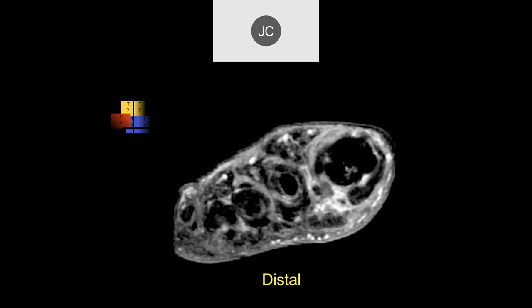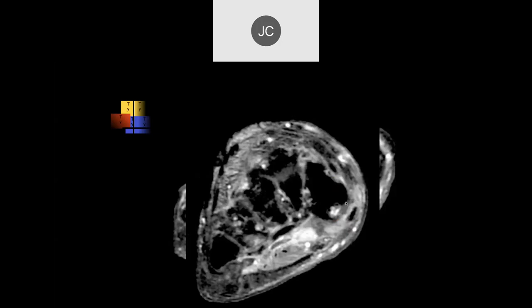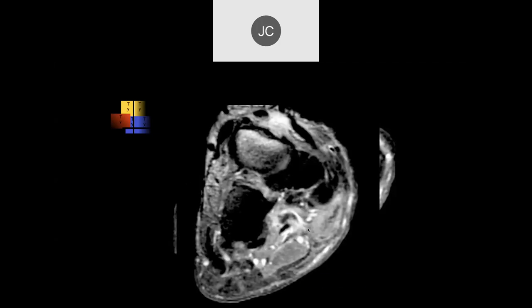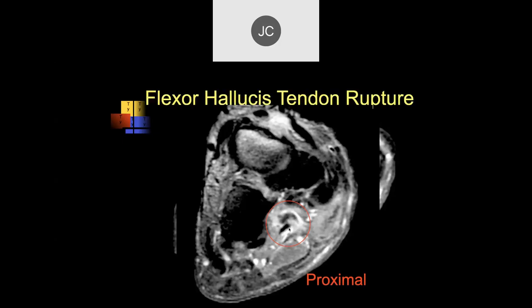There is high signal on the plantar flexor tendons — flexor digitorum and flexor hallucis longus. There should be medial and lateral sesamoid phalangeal ligaments, with a flexor hallucis longus tendon in the middle, but it's not there. Going back posteriorly, here's the brevis but there's no longus. As we keep going back, we reach the area where the digitorum and longus cross over each other. This was a distal flexor hallucis longus tendon rupture with retraction.